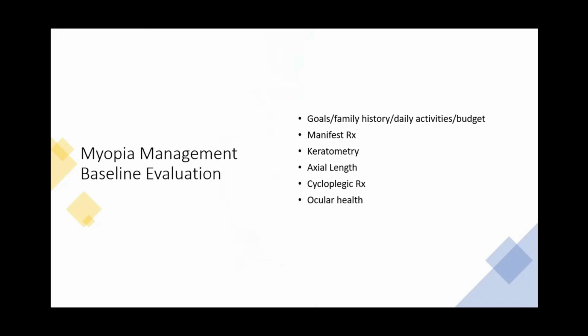So, the main purpose of the myopia control baseline evaluation exam is to gather as much information as we can to describe the status of the eye, its refraction, as well as information about the patient.